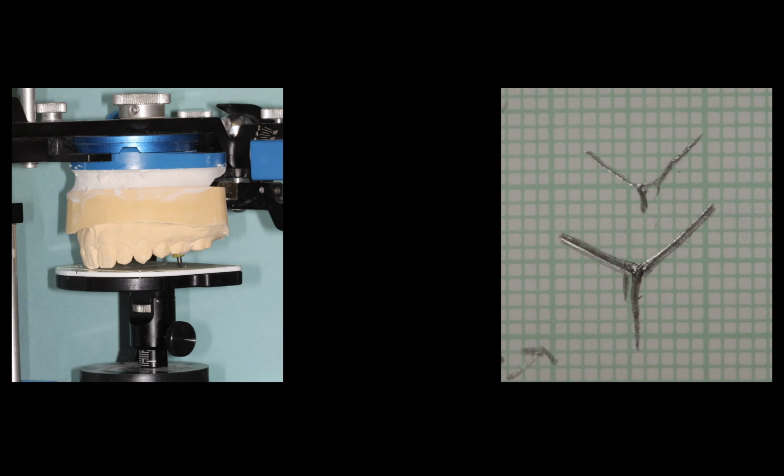We did something really fun at the VA West Los Angeles. We took patients, we located kinematic axis with a facebow, mounted their casts. We also used a Kois dental facial analyzer and mounted those casts. And then we drilled holes in the center of the first molar and put a lead pencil lead in it with spring loaded, and then traced working and non-working pathways on a piece of graph paper. And the reason these graphed markings on the right have a tail is for reference, and we opened the articulator, so rather than a Gothic arch, it's just a reference Y shape.